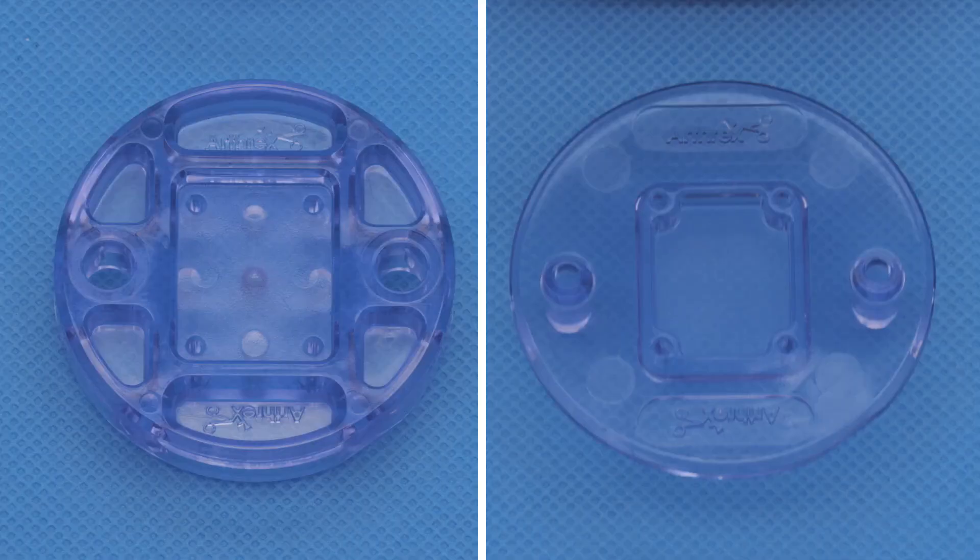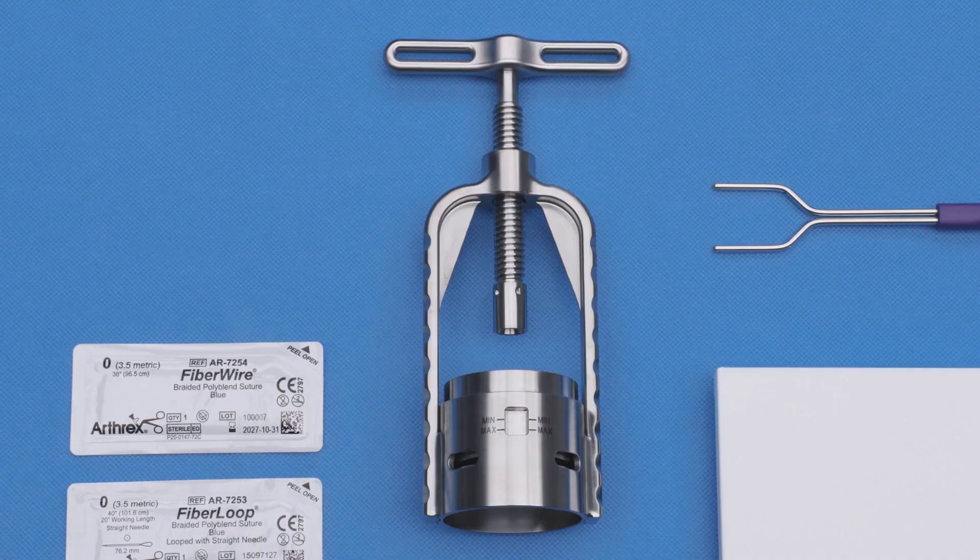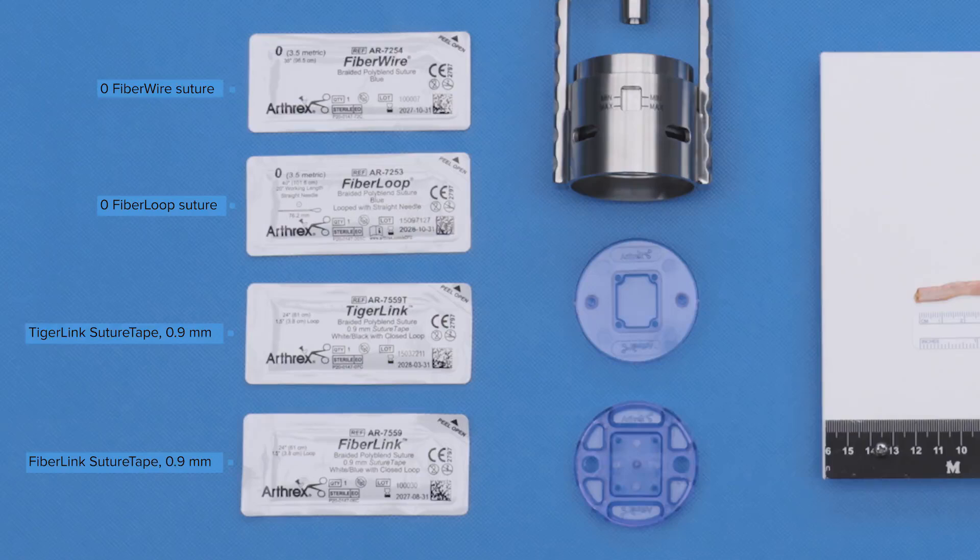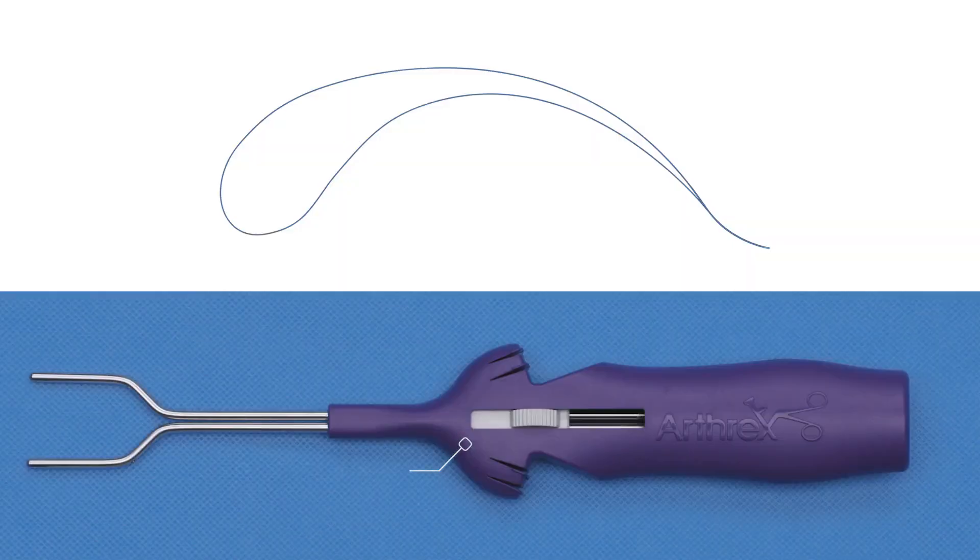To prepare the graft, you will need the compression plates, the MGS press, four sutures, a fiber loop suture, a zero fiber wire, a TigerLink suture tape, a fiber link suture tape, and a graft spreader.